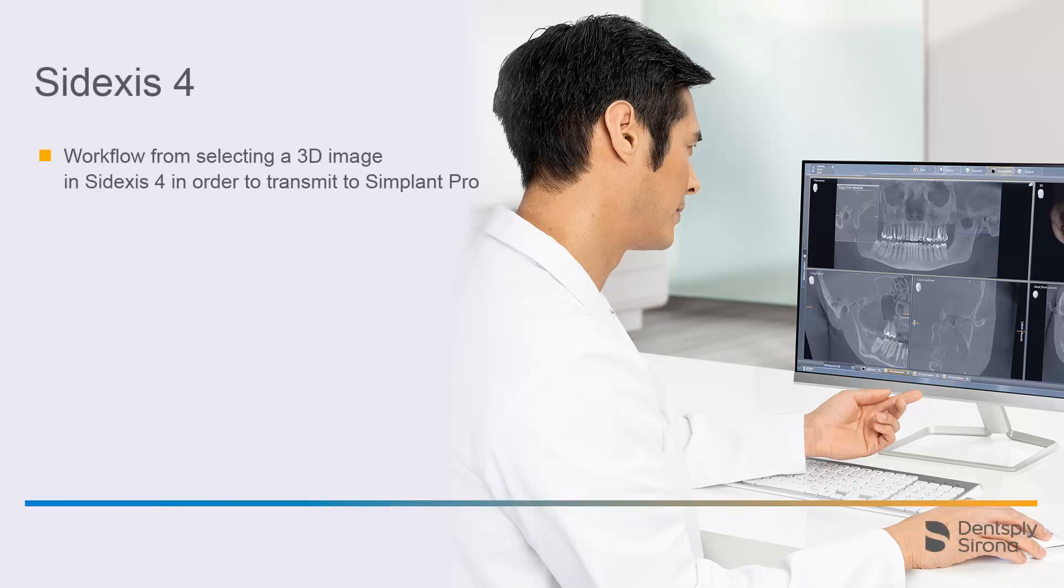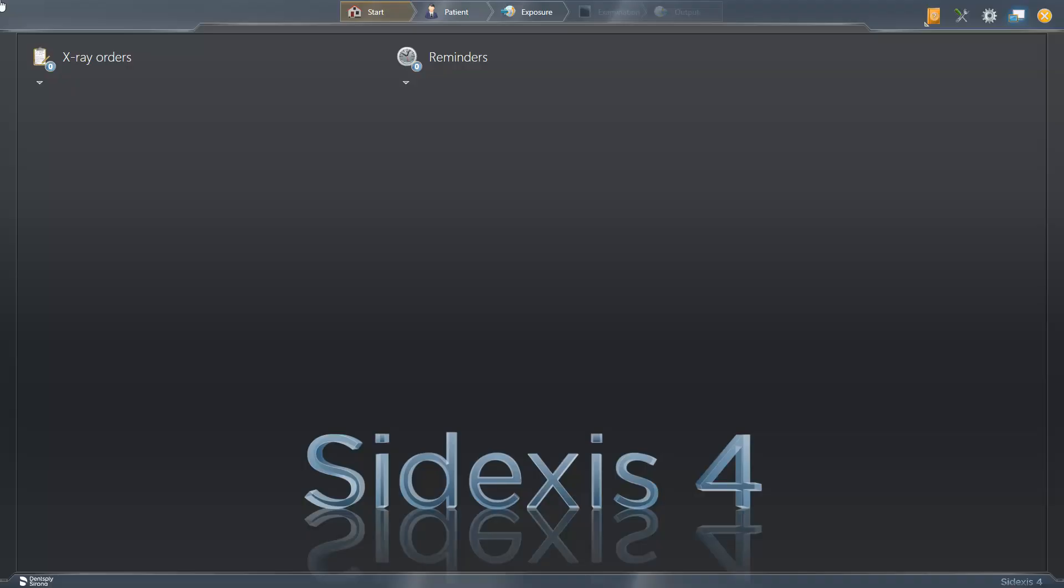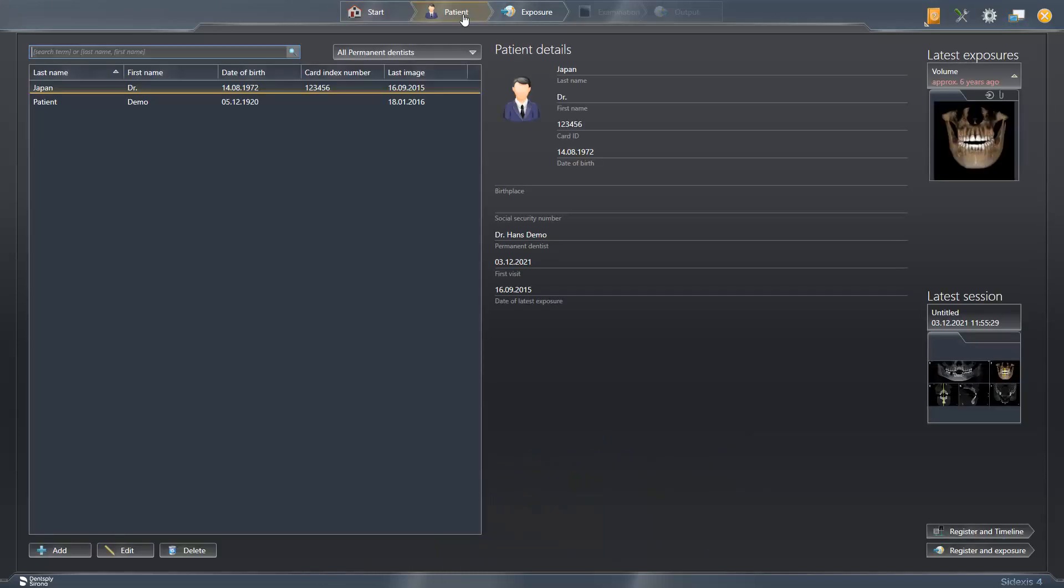Welcome to this video tutorial on Sidexis 4 software. We have opened Sidexis 4 and first switched to the patient step. Then we select our patient with a double click.